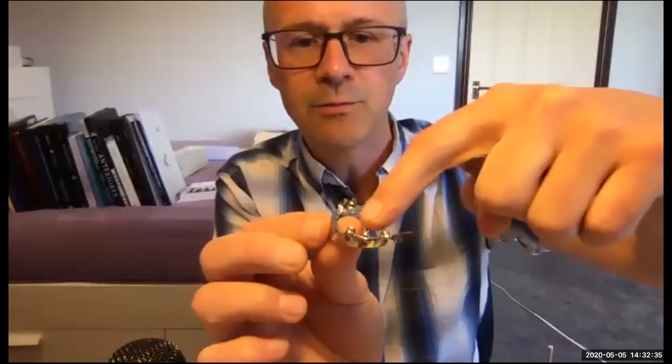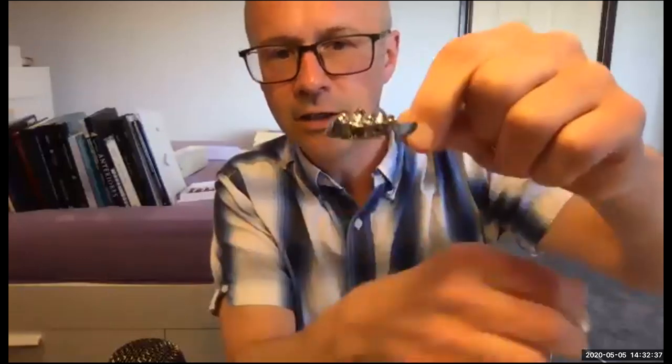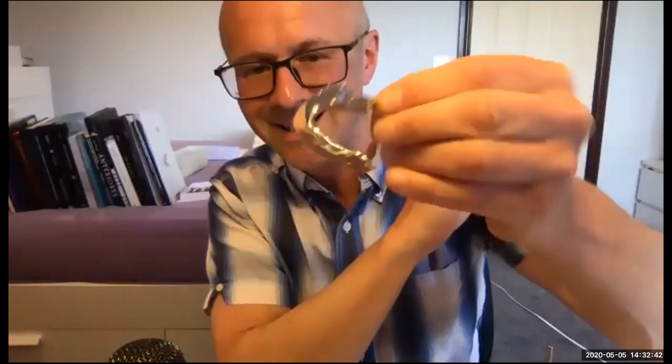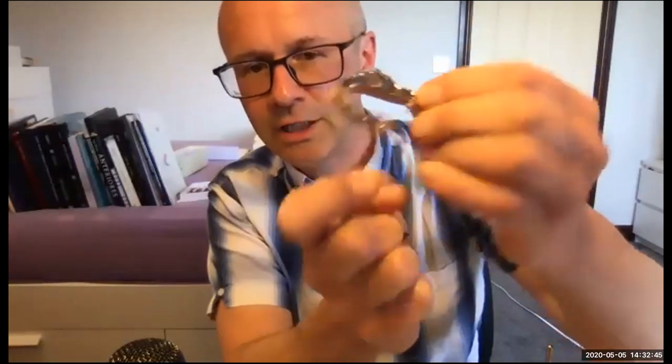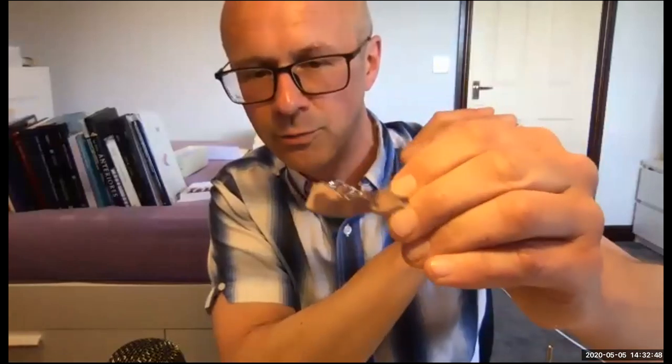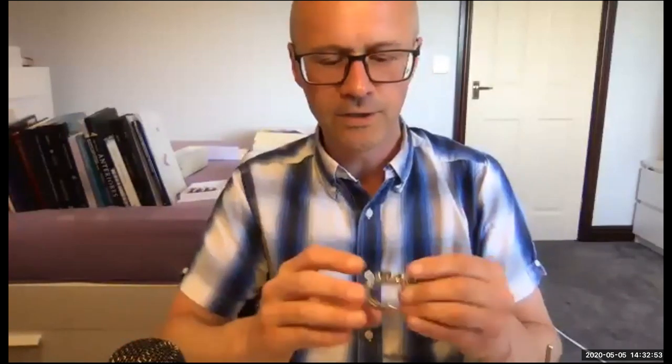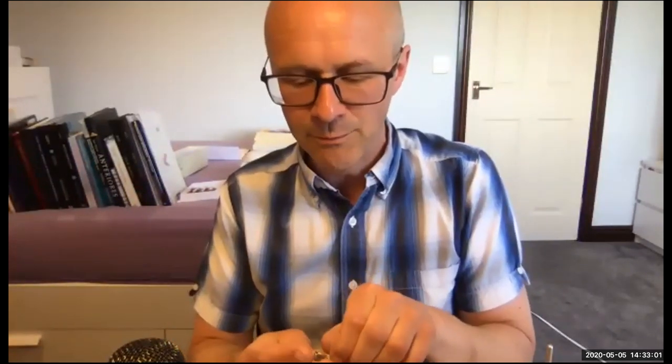So we've got implants placed in the maxilla here. It's a parallel bar, and then there's a sleeve that gets encased in a denture. It's got a Mark II attachment. This is an R.E. Burke bar, Ruth Burke's design, and this all slots in together beautifully and fits. It's fantastic, and this is using quite a long cantilever. The main issue with Olive was that she lost that anterior implant that supported it, and as soon as that was gone, we were goosed, as it were.